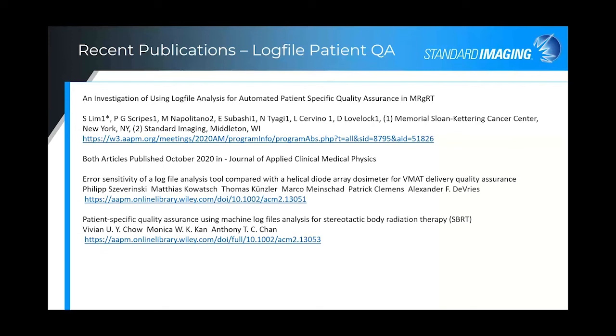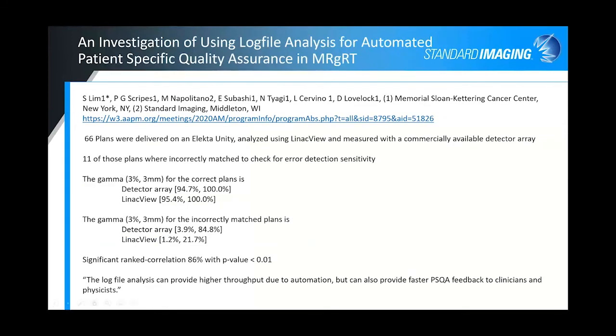And just in general, I'll have to say these types of analysis programs provide an end-to-end plan transfer as well as beam delivery checks. And so now I'm going to take just a few minutes to go over some of the data in this first presentation. So this is a poster from AAPM entitled An Investigation of Using Logfile Analysis for Automated Patient-Specific Quality Assurance for an MR LINAC.